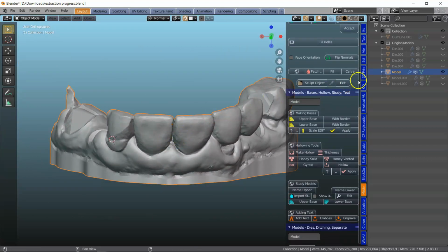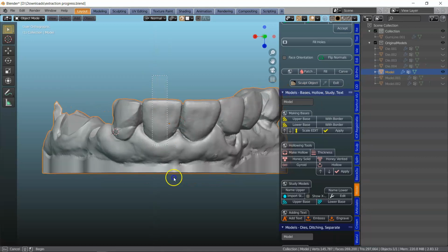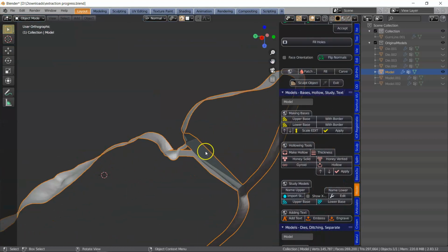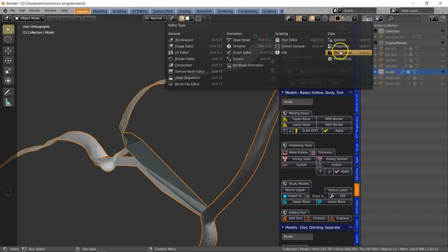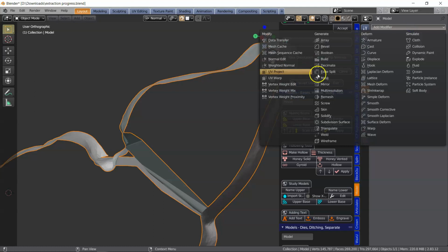I can only think of one thing, and it's maybe to remesh this, because the inside, as I said, has got all of this stuff on the inside. So let's just have a look if we remesh. Okay, properties. Here's a Boolean tool. Let's just get rid of that.